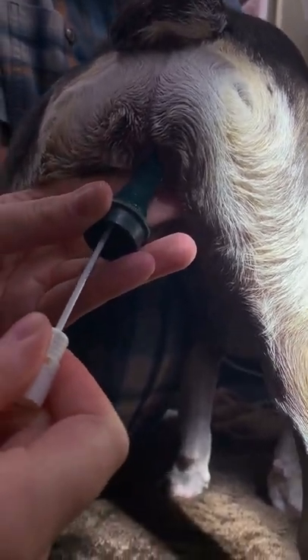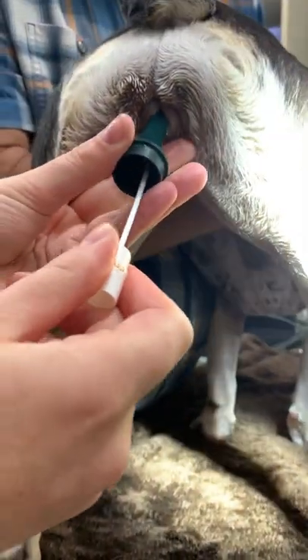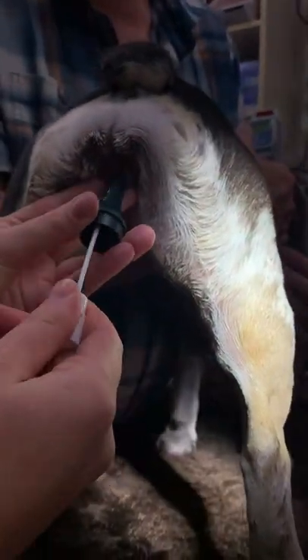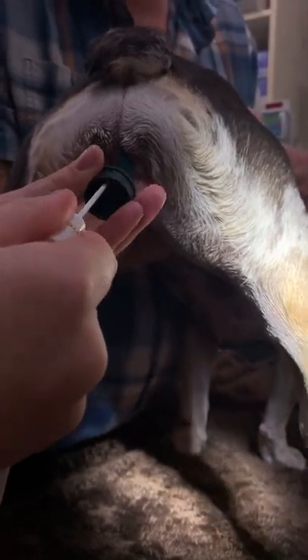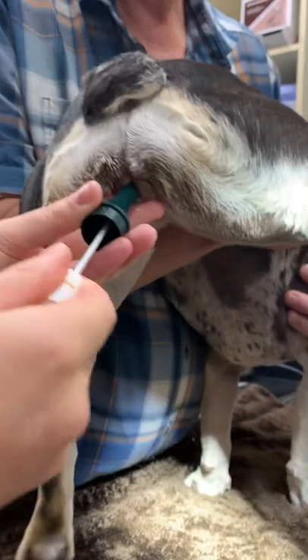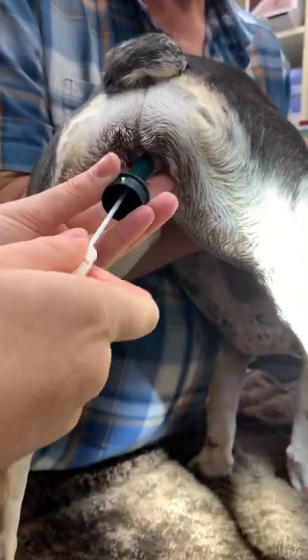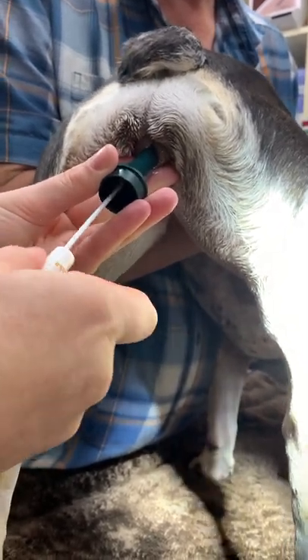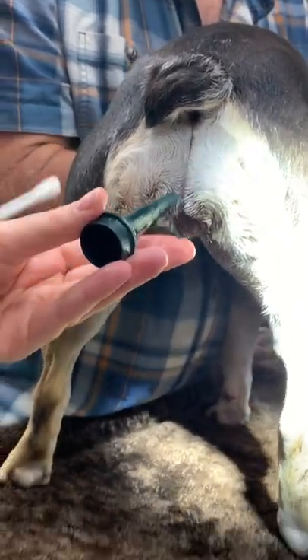I'm getting some resistance here, so you need to lift it up. Up, up, up — that's it. Now advance your swab. There we go. Do some rotating there. Good. Now pull your swab out — there you go. Excellent.